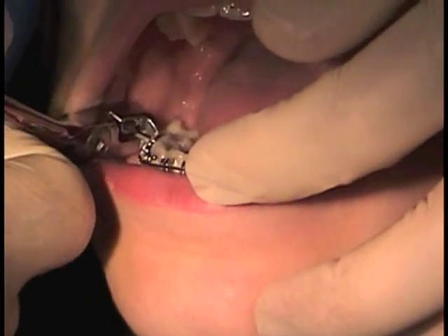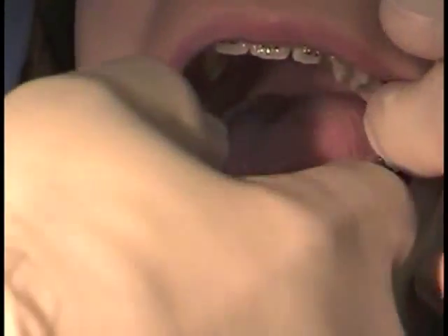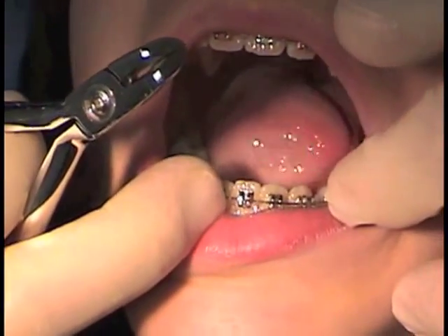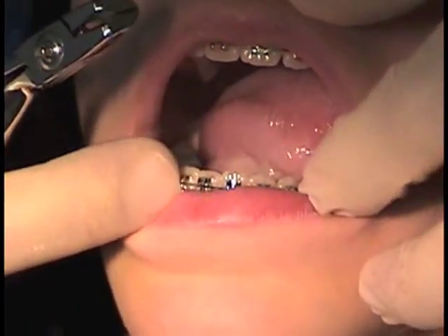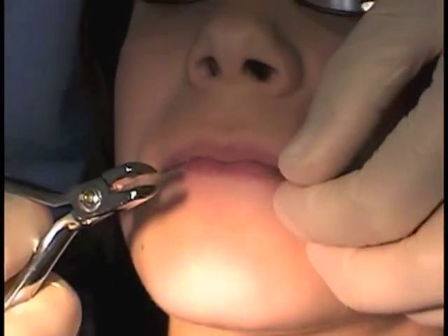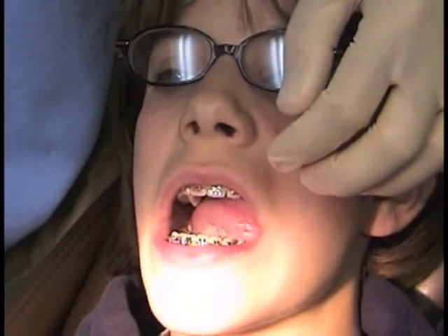We clip the end on one side and on the other. This wire is ready to be tied in, and it will open her bite at the rate of about 1mm to 2mm per month. So that's how you use arch wire curves.